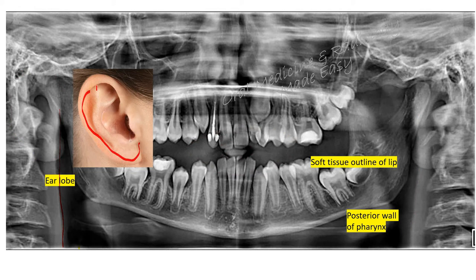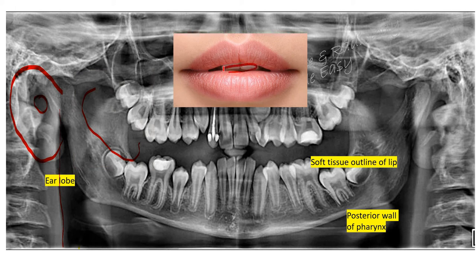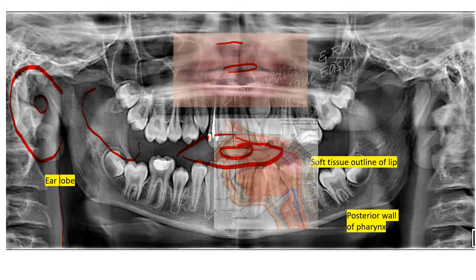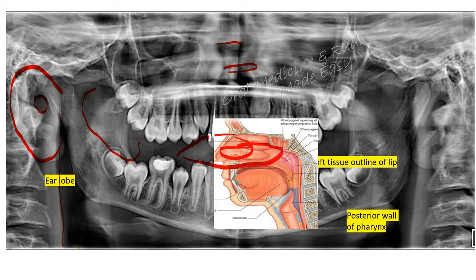This is the earlobe, which is evident as a shadow here. This is the earlobe and this opening is evident here, and this outline of the lips is seen as a faint shadow at the center — this is the lip. This is the posterior wall of the pharynx, visible on either side. So these are the three soft tissue landmarks seen here.